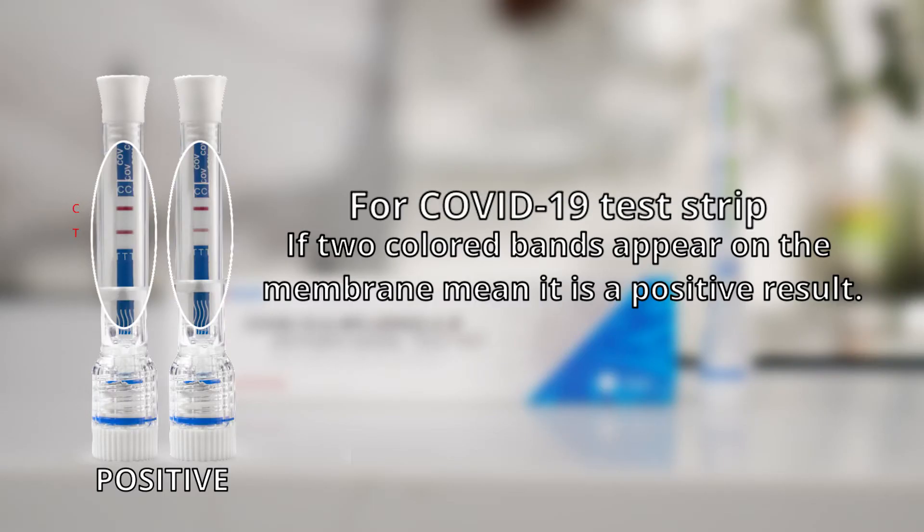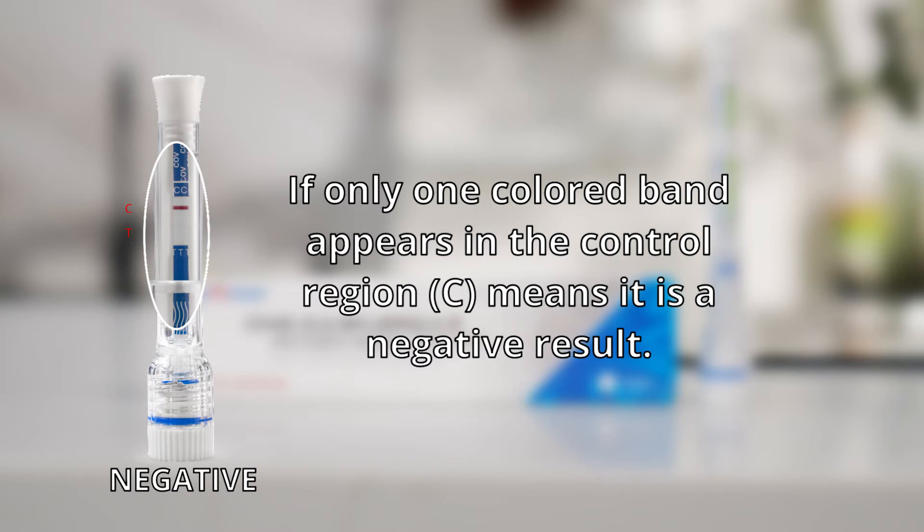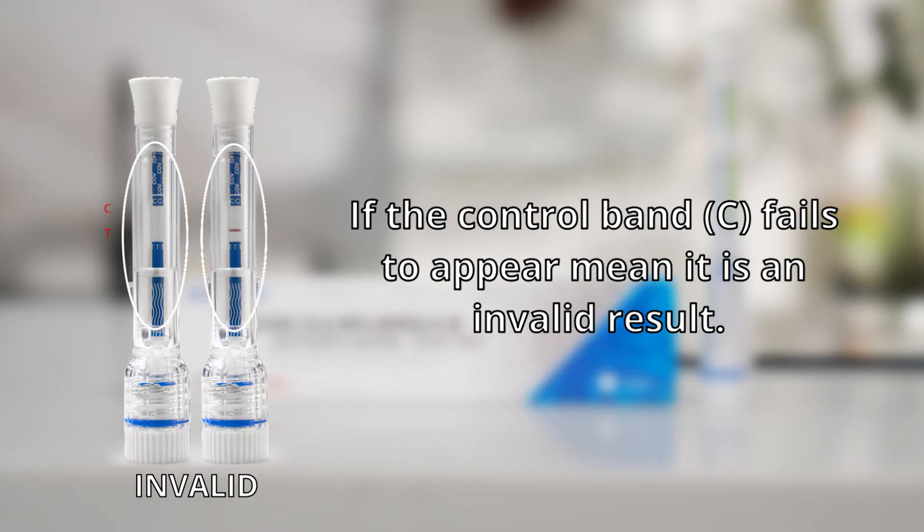For the COVID-19 test strip: if two colored bands appear on the membrane, it means a positive result. If only one colored band appears in the control region C, it means a negative result. If the control band C fails to appear, it means an invalid result.